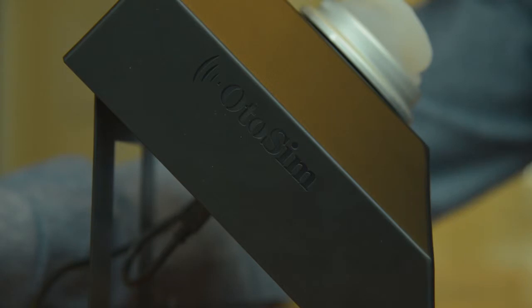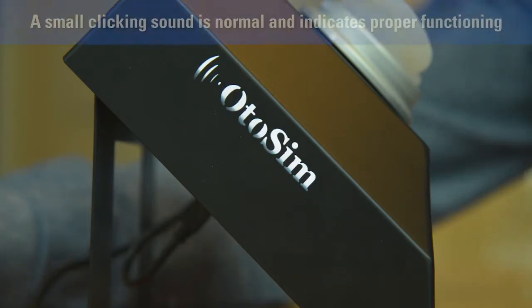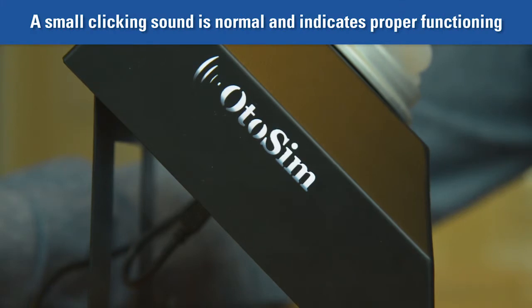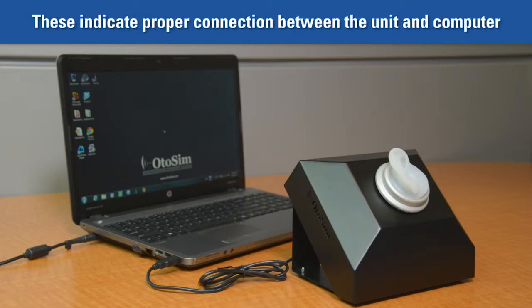Once the display unit is connected via the USB cable to the computer, the OdoSIM logos on either side of the display unit should become illuminated. You may notice a small clicking sound when you connect the unit to the computer. Also, you will notice a blink on the computer screen and perhaps a slight change in the screen resolution. These are normal and are good indicators that the computer has recognized the unit.